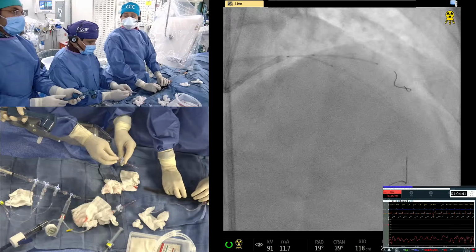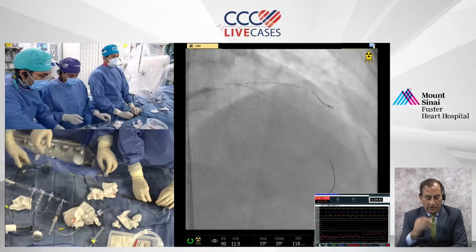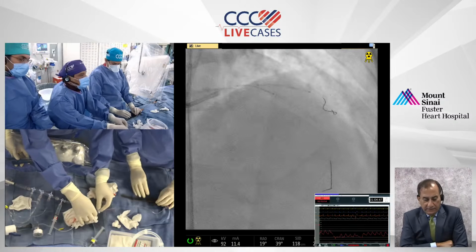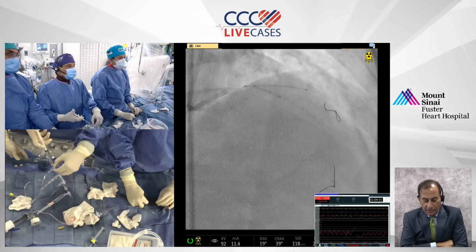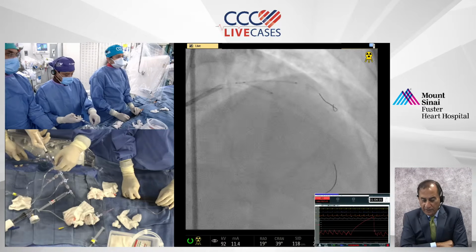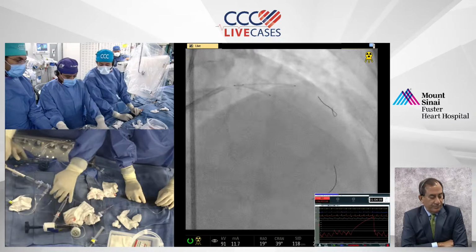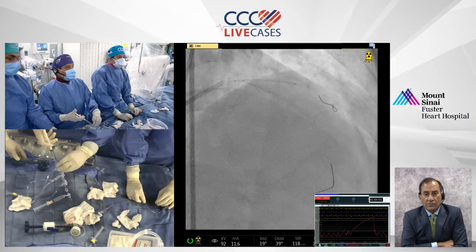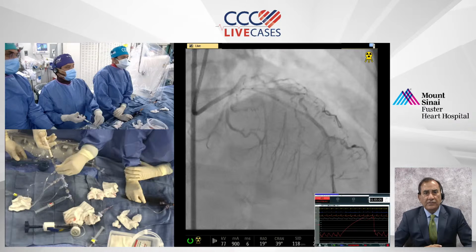So this is a little note by Jeffrey Wilson. I think it got delayed in reaching us, catching up, but agree this should get IVUS first. I bet Rota not needed. Any calcium will not be thick and would be treated with balloon only. Also curious to take a picture of the left main. Yeah. So all good points, and we covered them in our previous discussion.